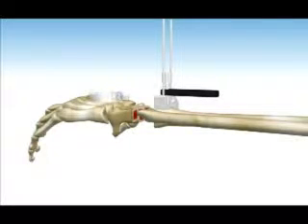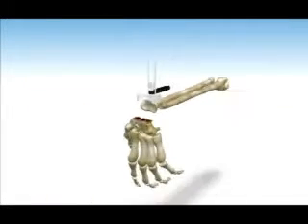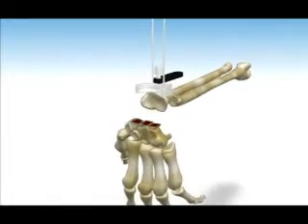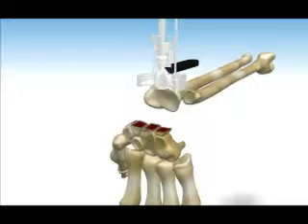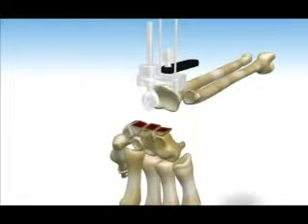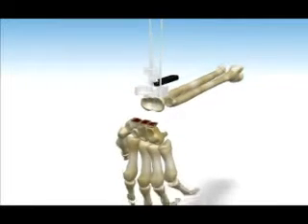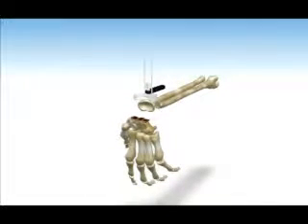Step 3. Insert the PGT radial resurfacing guide into the PGT guide. Tighten at the proper height to adequately contour the scaphoid and lunate fossa. The PGT radial burr should remove excess bone on the radial fossa and central ridge between the scaphoid and lunate fossa. Care should be taken not to remove too much bone and not to resect subchondral bone as a press-fit application is desired. Remove the radial resurfacing guide.